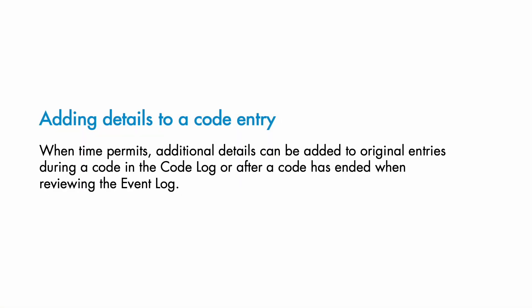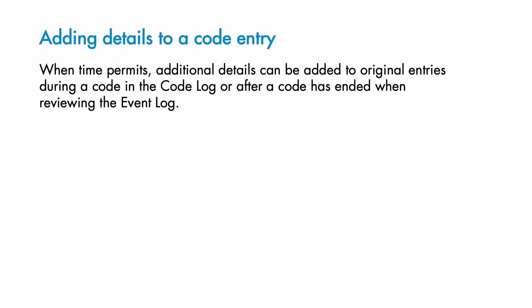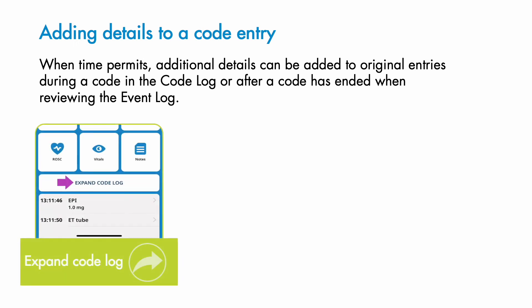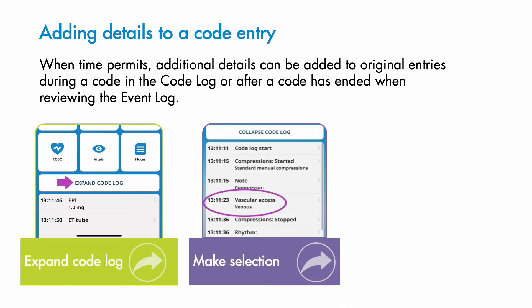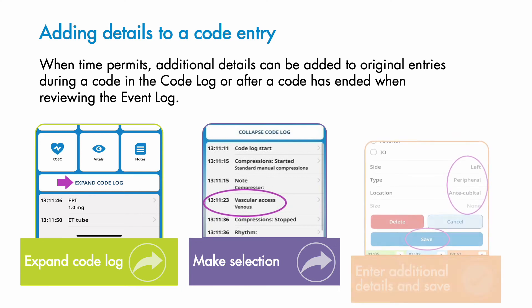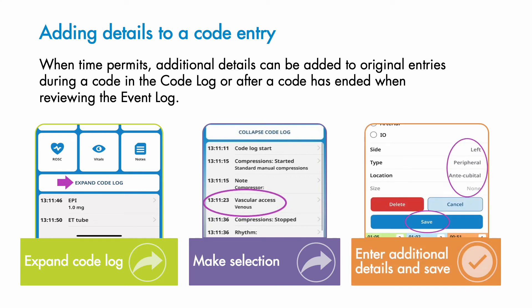When time permits, original entries made during a code can be modified or enhanced by adding additional details in the code log. Simply tap Expand Code Log, select the entry you'd like to modify, add any additional details, and hit Save. Details may also be added to code log entries after a code is ended by selecting the entry in the event log, making changes, and hitting Save.